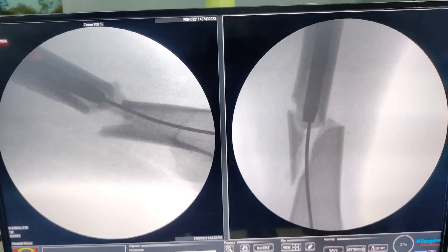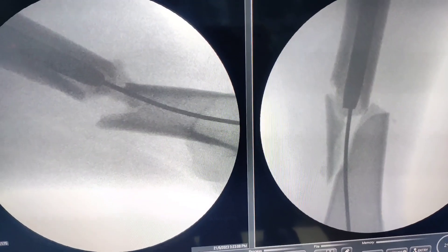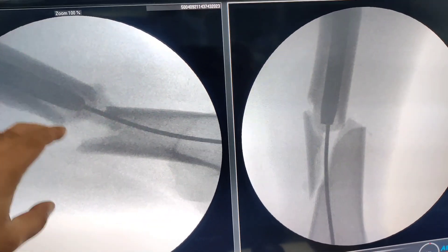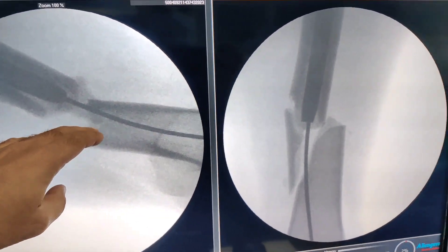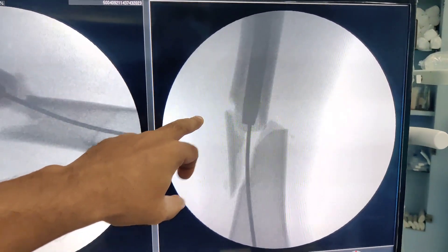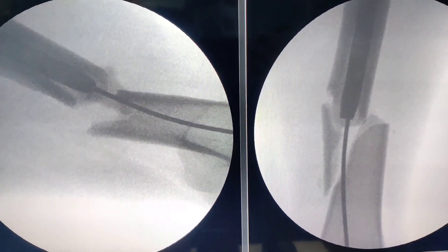We are doing the nailing of a distal femur which is multifragmentary. This is the lateral view — this is posterior, this is anterior. The distal femur is always flexed. This is the AP view — this is the lateral side, this is the medial side — and irrespective of how hard you are trying to reduce it by external forces, it can sometimes be very challenging.